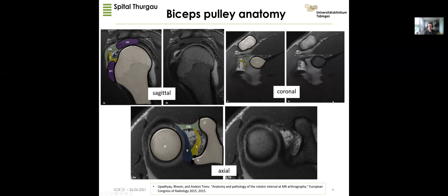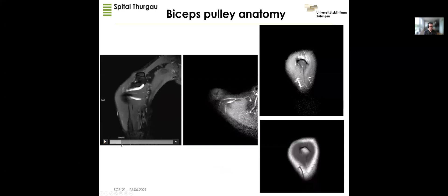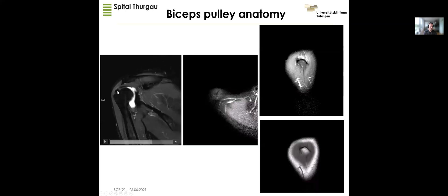The coronal view is the least important due to the huge variability of the SGHL, making it difficult to detect these structures. The coracohumeral ligament is shown here, and the SGHL is sometimes problematic to detect. Nevertheless, I normally start to look at the shoulder joint with coronal views. Here we see the subscapularis tendon and coracoid process, and going further along in a patient with shoulder band, we see the cause — it's a patient with tendinosis calcarea. This is the supraspinatus.